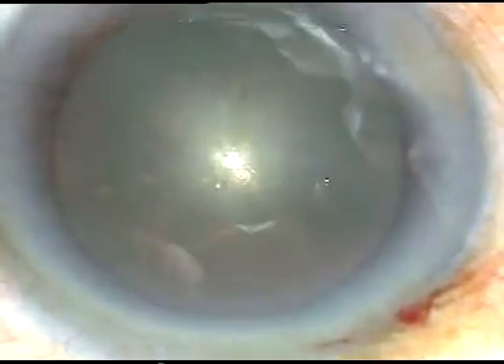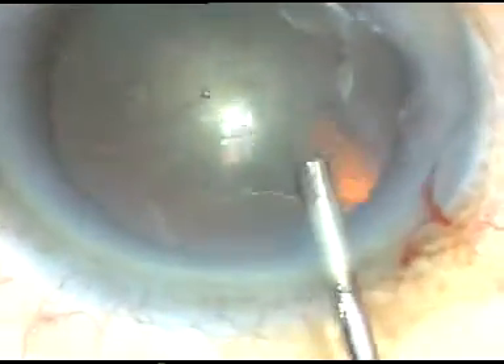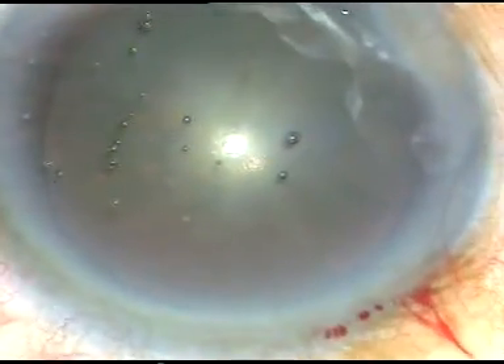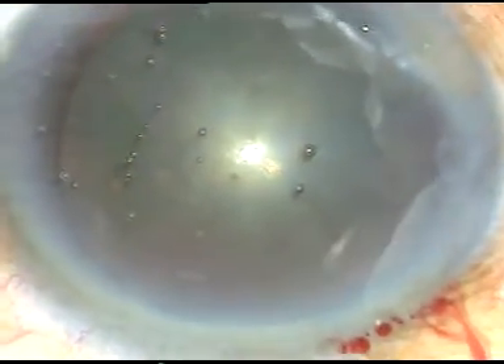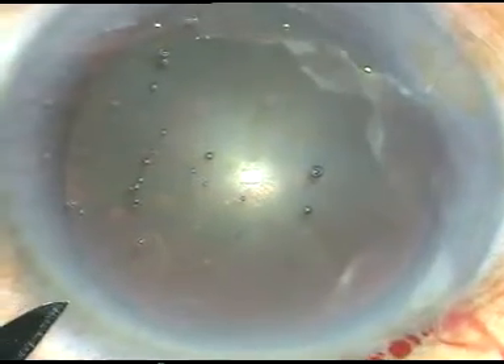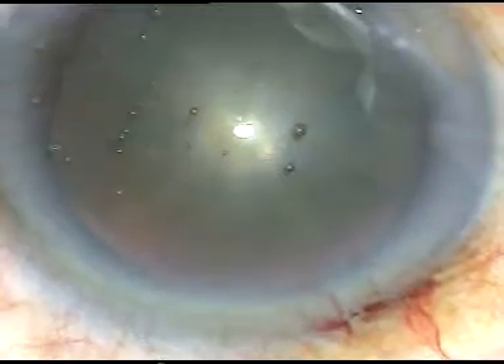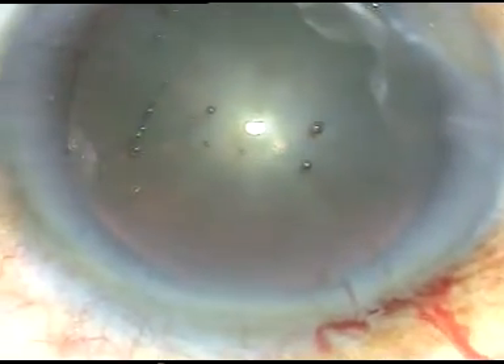In soft cataracts, it is not safe to do a trench because the nuclear mass is so soft that while you make a trench, at that time itself, as you go deep, you can pierce the posterior capsule with your phaco tip. Yes, it has happened in my hands.